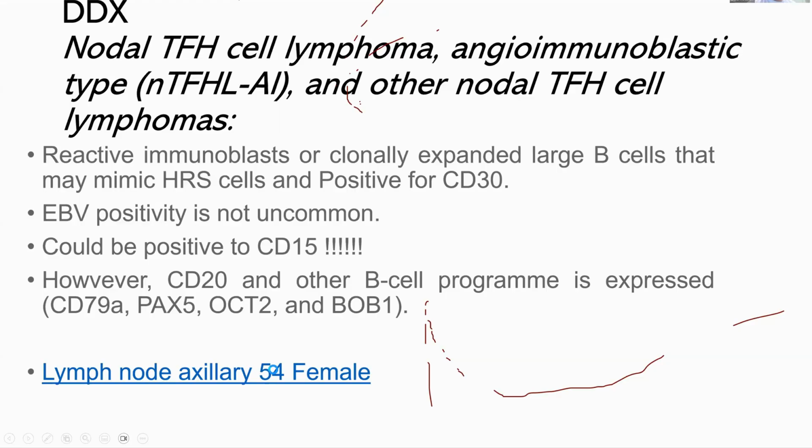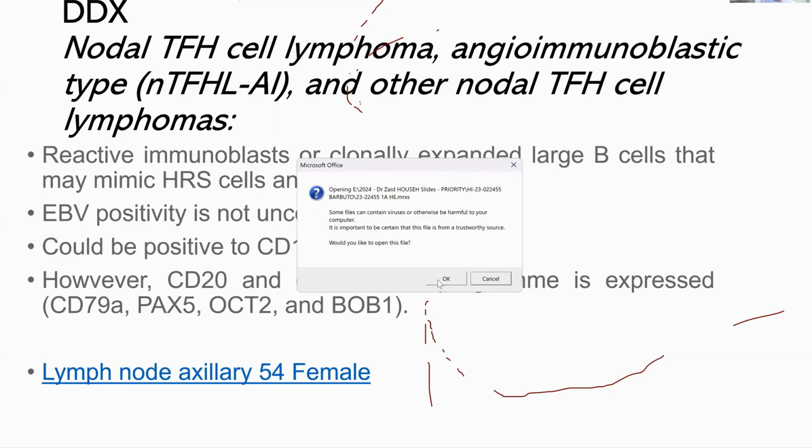I'll just show the immunohistochemistry of one example of these angioimmunoblastic T-cell lymphomas, or nodal TFH T-cell lymphomas.